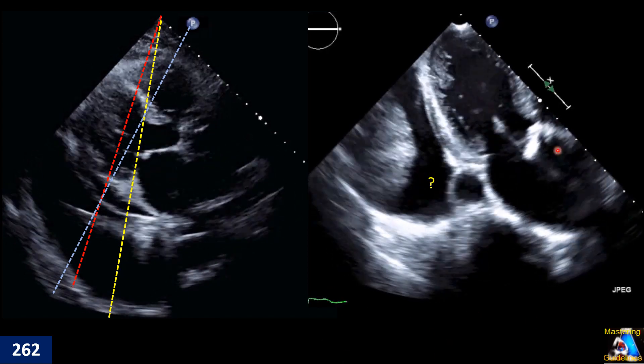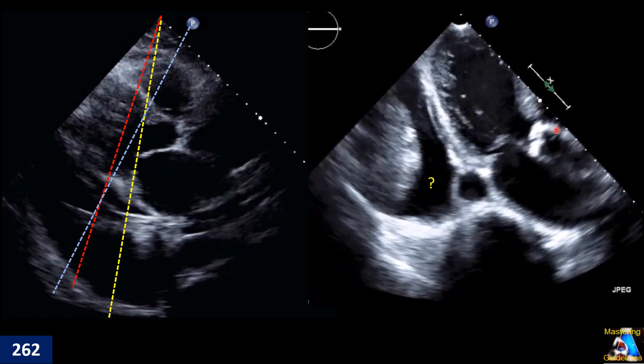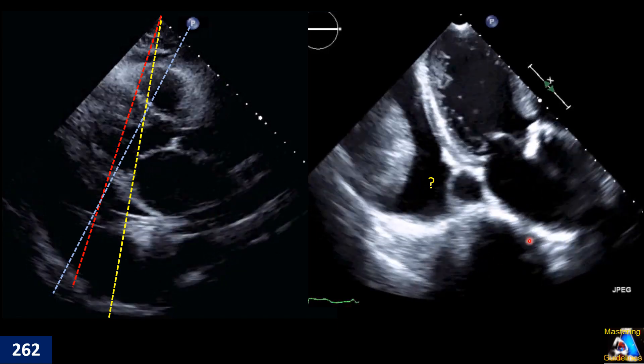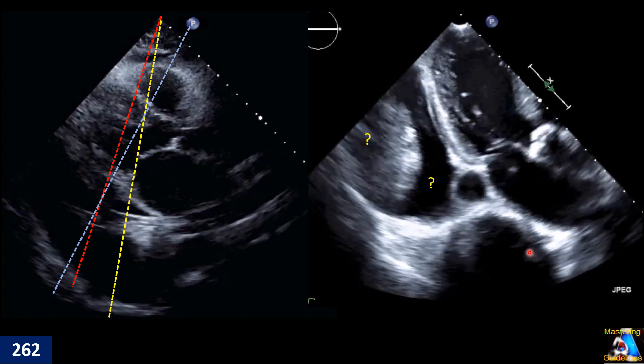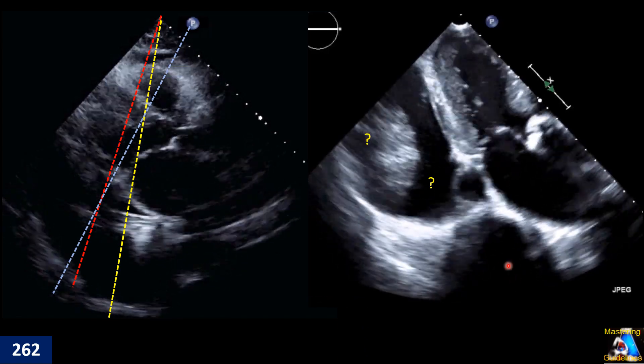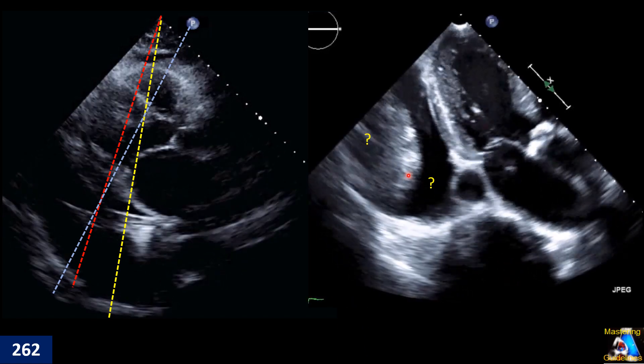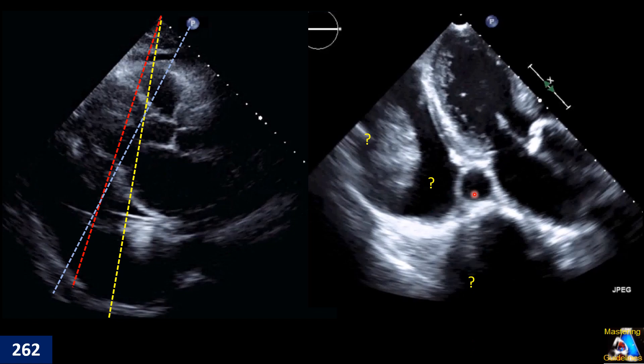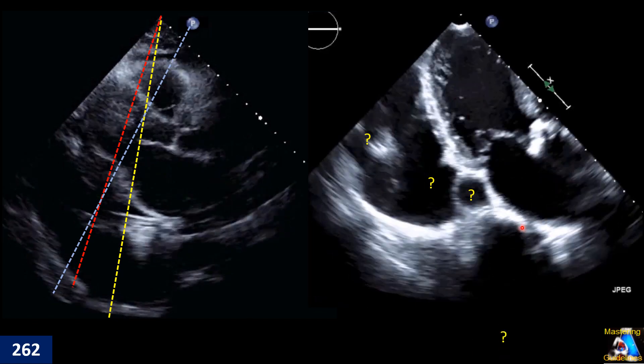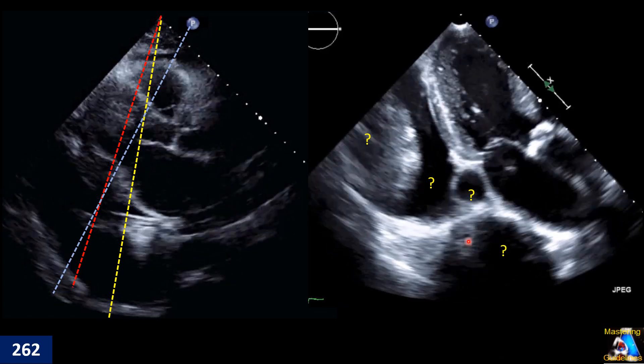Here is another view — almost an apical three-chamber. Let's see what those structures are: this one, this one, this one, and here.